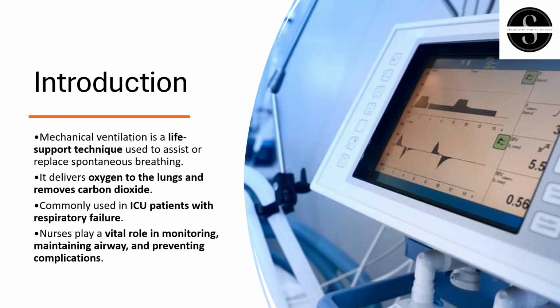Coming to the introduction. What is mechanical ventilation? When the patient is unable to take their breath manually, they prefer respiratory support, which is through a ventilator. That is called mechanical ventilation. In simple terms, mechanical ventilation is a life support technique used to assist or replace spontaneous breathing.